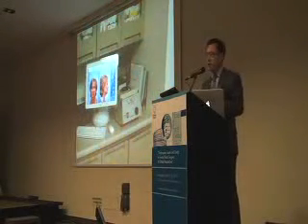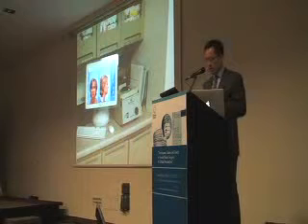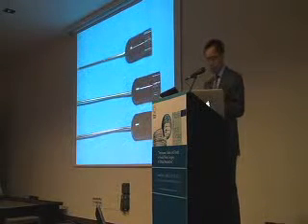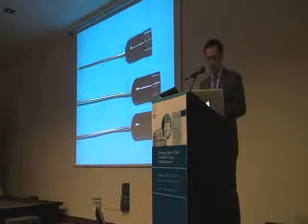And then I always have a photograph of the patient in the room so that I can take a look at what's going on and reference how much volume I need. These are the cannulas. The 1.2 millimeters are at the bottom, and then the 0.9. You can see how flimsy this is. I don't use a lot of 0.9 because it bends too easily, in my opinion.